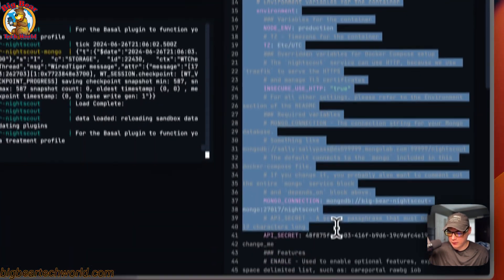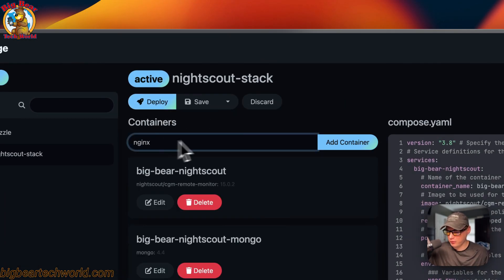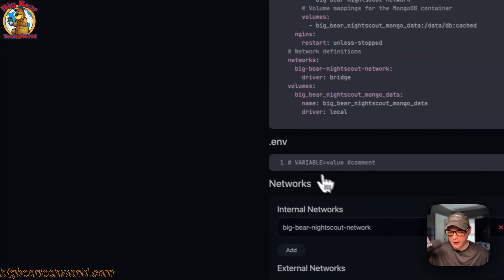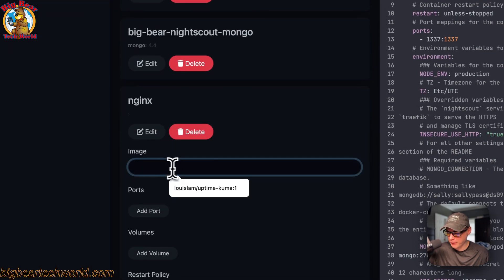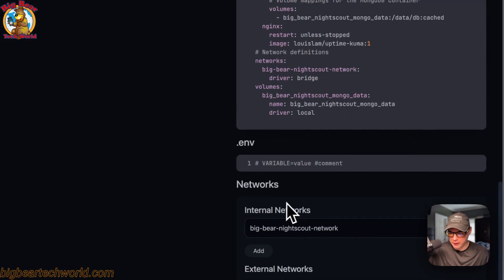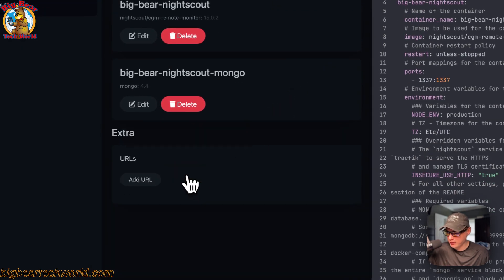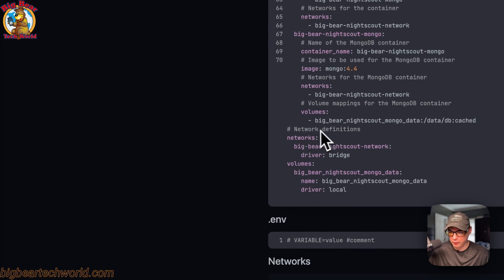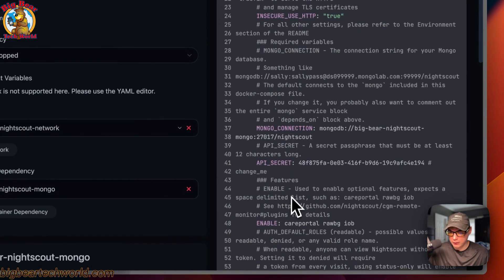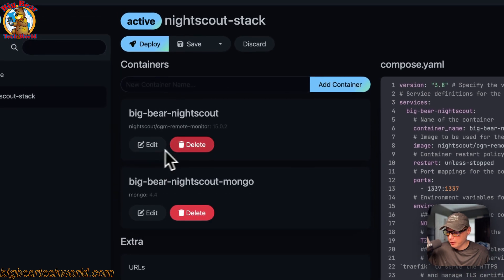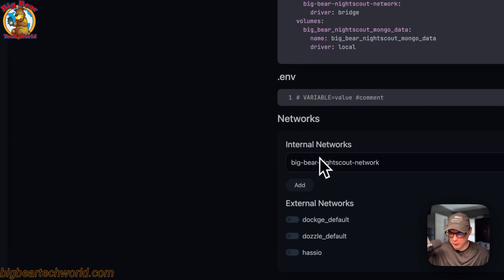If you want to edit the Docker Compose you can click Edit. You can add a service underneath services, and it will appear both in the UI and in the editor. You can add an image to a service by going in and adding it — it updates both views. If you want to remove a service, click delete and it's gone from both the UI and the editor. You can edit a service directly in the editor or through the UI — they work vice versa. You can also add volumes, set environment variables, and change networks — both internal and external.